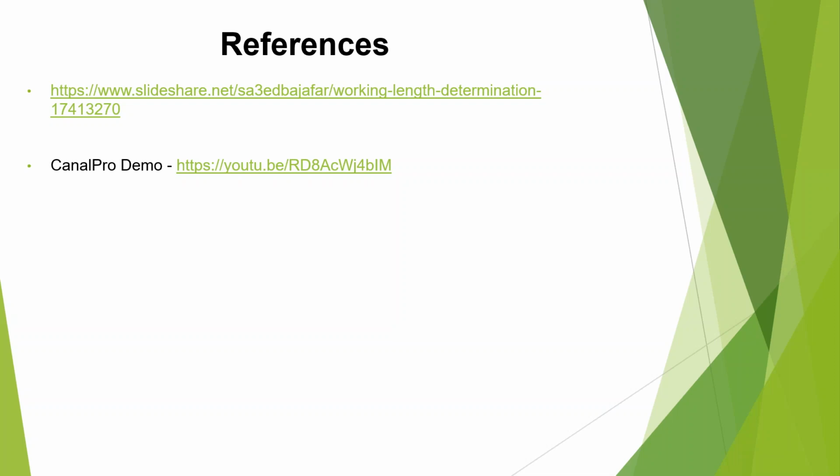But do you guys remember what Gray said as far as files being too long? What percent of cases is the working file usually too long? I want to say it was like 90. Like 90%, that's exactly right. The working file is usually long 90% of the time. If the working file is at the radiographic apex on the PA, subtract 1 millimeter from the working length.